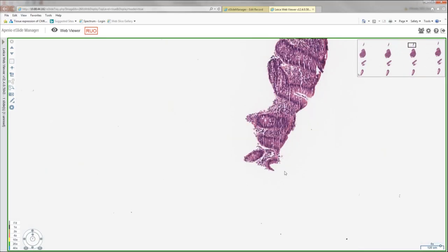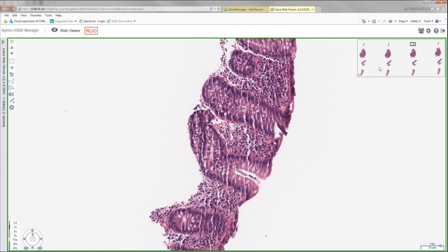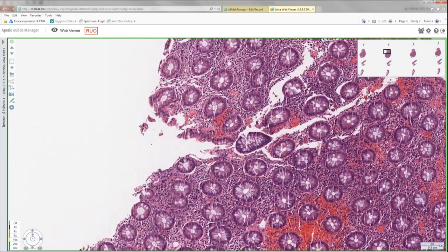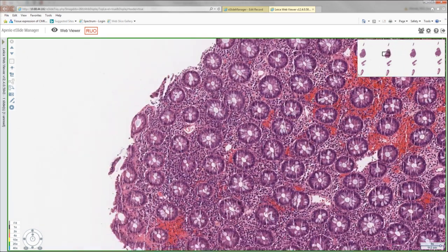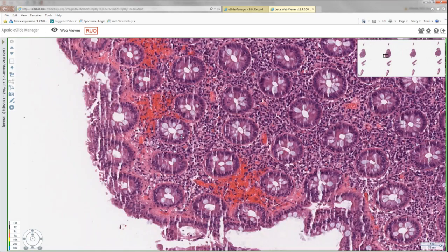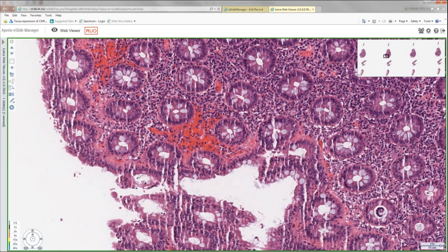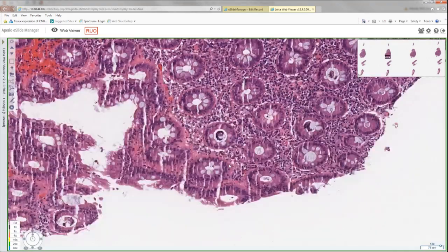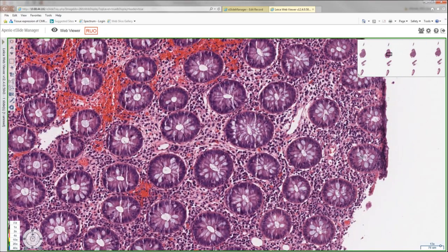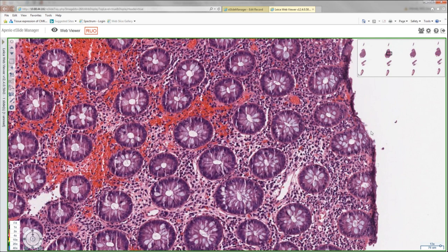So let me keep going and show you other areas of this biopsy. We're gonna go to a different field. And there's a little delay, so I know that you may not see it right away. But anyways, here, more lymphocytosis at places. The surface epithelium was at places okay. Some areas had a few less goblet cells than we would like to see. It was slightly denuded at other places. Here it is a little more attenuated as well, with a few lymphocytes.